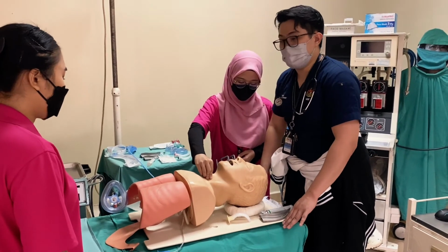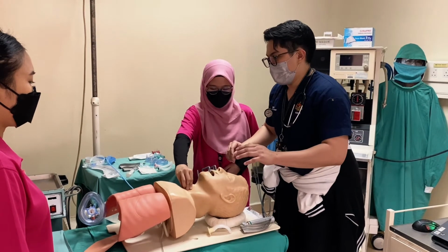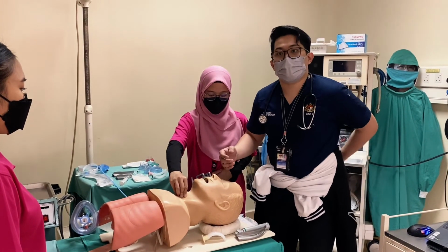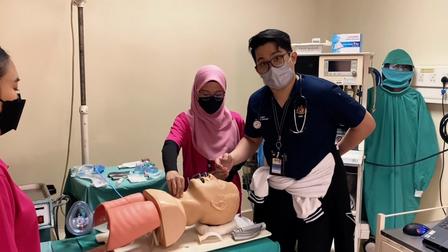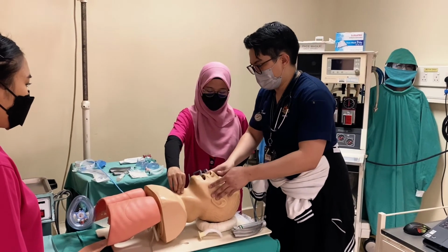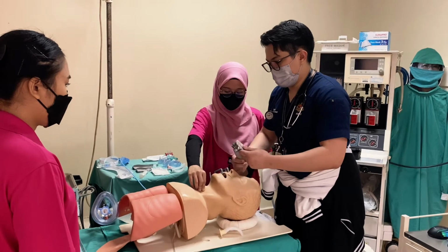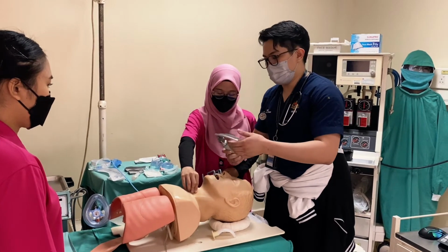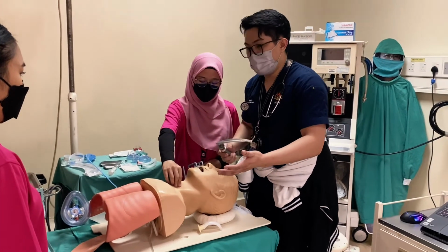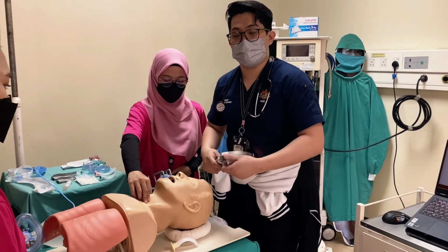When we prepare everything already, now, side notes, when we do this, it's important that the level of our bed is the level of our hips. Because if we do it in an uncomfortable position, it may give us a long-term backache, especially during this intubation. We must make sure our assistant will be on our side. This is our blade. I'll be using size 4 blade for now. It has various sizes, like blade 3 for a smaller adult, blade 2 for children or pediatric.